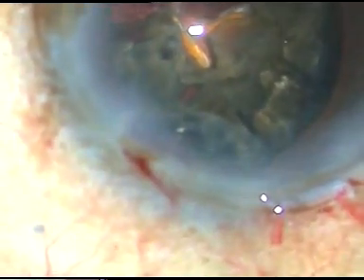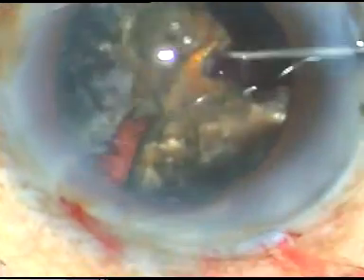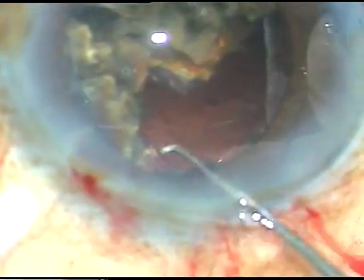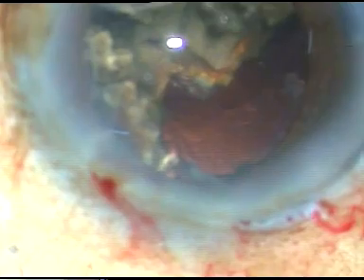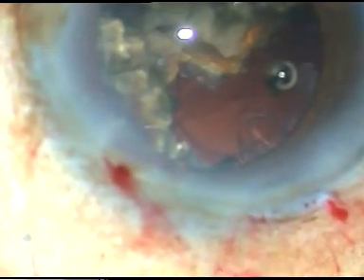The one hemi-nucleus is managed. Now this is the other hemi-nucleus. I come out to inject some viscoelastic substance to protect the corneal endothelium. If the cataract is very hard, we should come out in between, inject viscoelastic substance, and again start — rotating this nucleus and bringing the pieces in front of the opening of the phaco tip. And here it is — I am going again into the eye with some more visco, and again I enter into the anterior chamber.